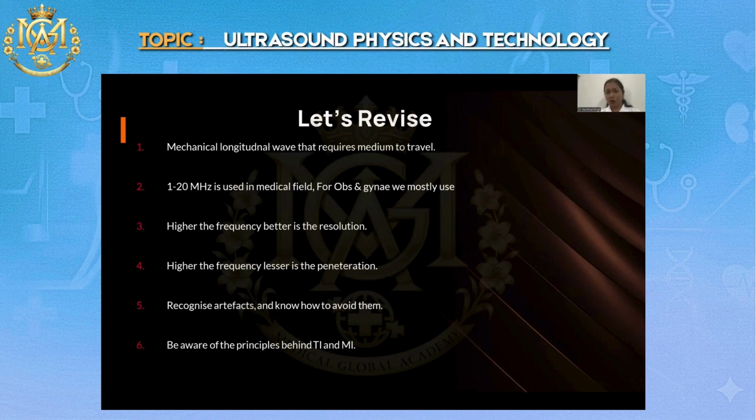So I hope you have revised the last class. What we discussed was that ultrasound waves require a medium to travel. Higher the frequency, better is the resolution. Higher the frequency, lesser is the penetration. We also spoke about artifacts, and we spoke about the thermal and the mechanical index. If you have not completed that class, please go and revise that before you come to this class.